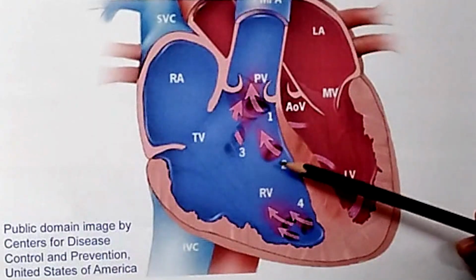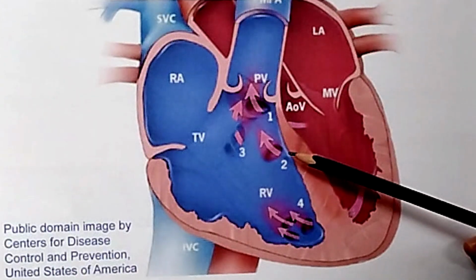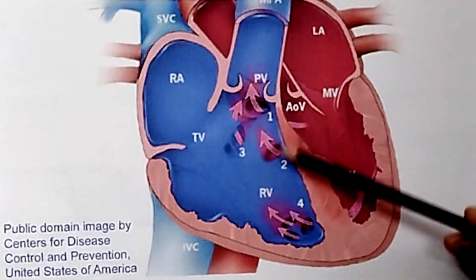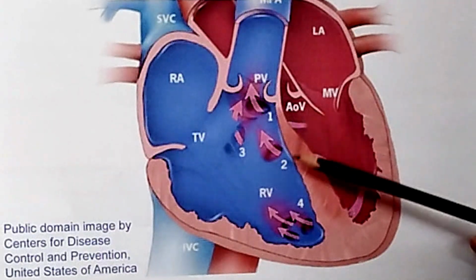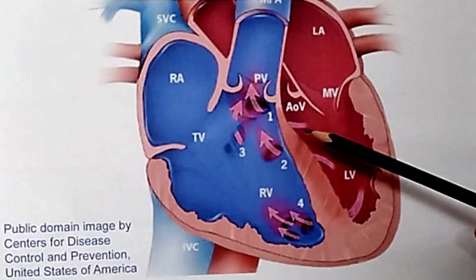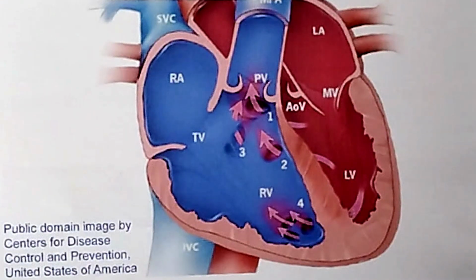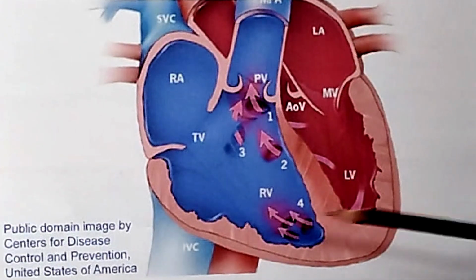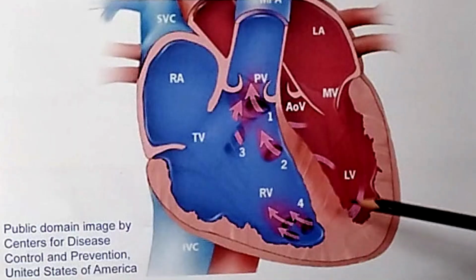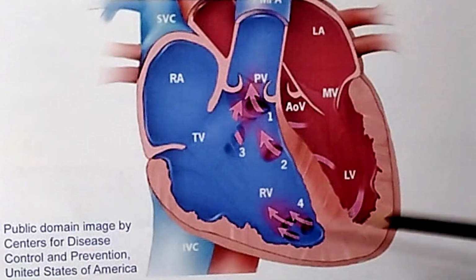One is aneurysm formation, second is attachment of the tricuspid septal leaflet to this defect, so that there could be associated tricuspid regurgitation then. And muscular VSD, which are often very small, are the most likely to close spontaneously by ingrowth of muscle. Muscular VSD closes more likely.